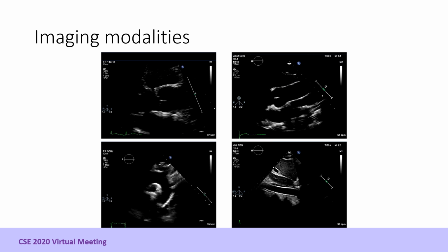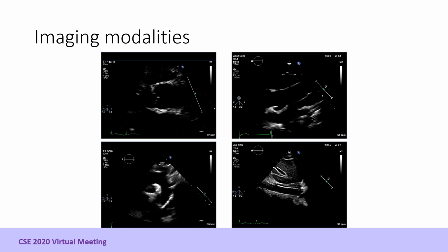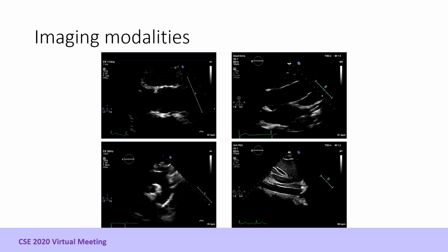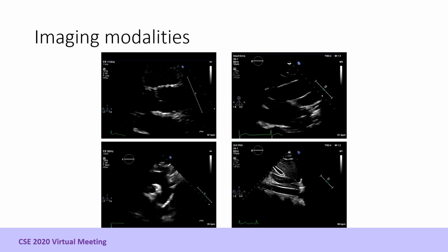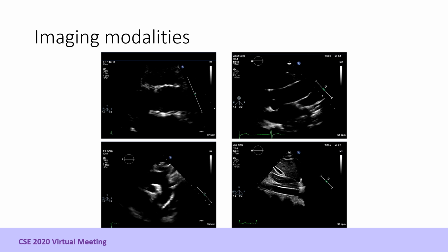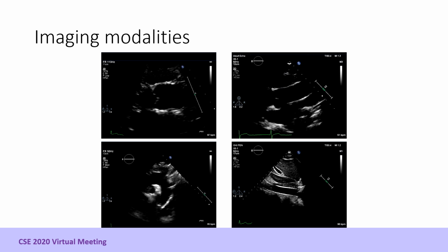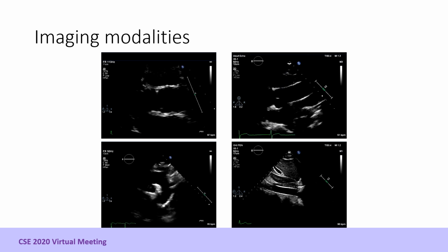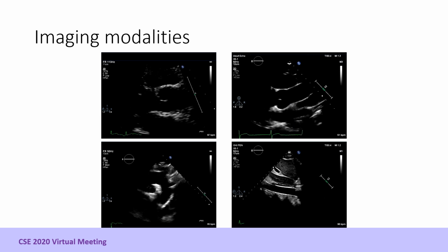The aortic root and proximal ascending aorta are best imaged in a standard left parasternal long axis view, shown in the top two clips, with a higher right-sided parasternal view sometimes proving more helpful for the more distal ascending aorta. The aortic arch and proximal descending thoracic aorta are best seen in the suprasternal view, shown in the bottom left. Aspects of the descending thoracic aorta can also be seen in the parasternal long axis, in modified apical views, and sometimes in paraspinal views from the back in patients with a left pleural effusion. The upper abdominal aorta is best seen subcostally, shown here in the bottom right.